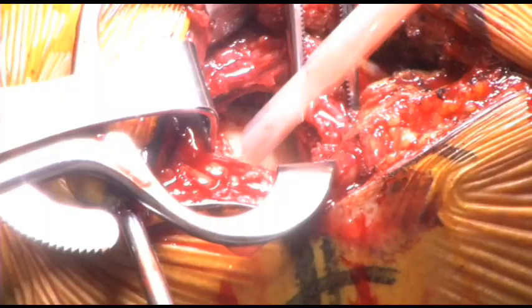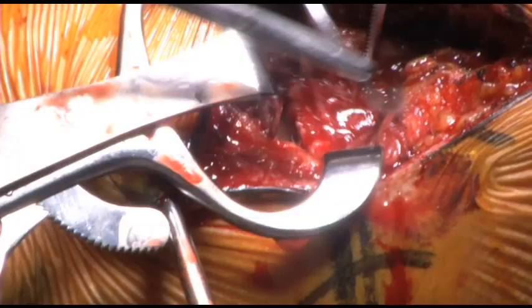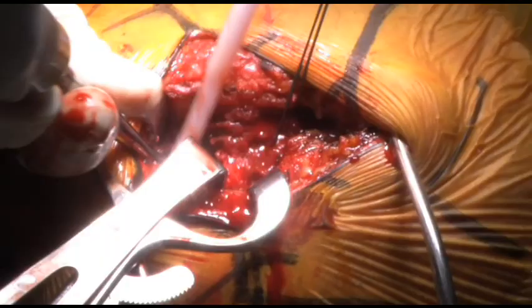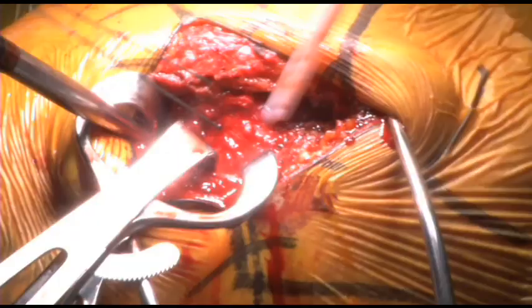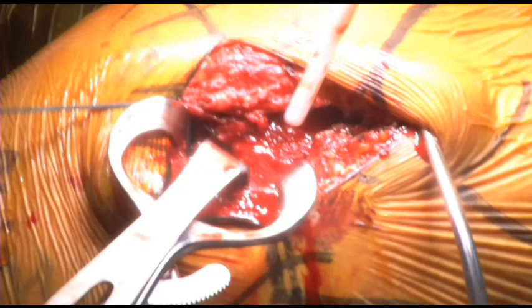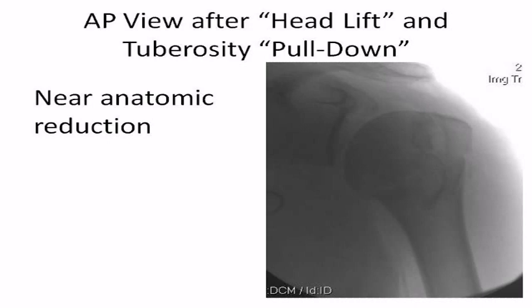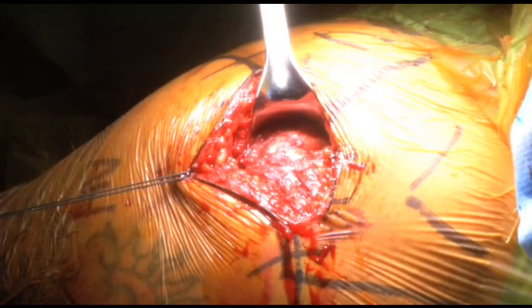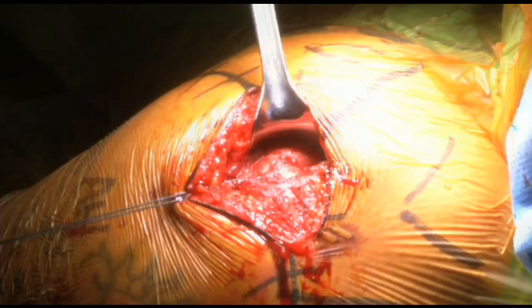The greater tuberosity can now be visualized displaced above the humeral head. A number five Ethibond suture is placed into the supraspinatus insertion to provide traction. A cob elevator is then used to lift the humeral head out of valgus. After the superior humeral head is elevated, the greater tuberosity is pulled lateral to the head and pressed behind it, usually locking both the tuberosity and humeral head in near anatomic position. At this point the reduction is checked fluoroscopically. The rotator cuff is completely intact with no tears. The key is to get the head reduced in the near anatomic position and pushing the tuberosities underneath it to support it.